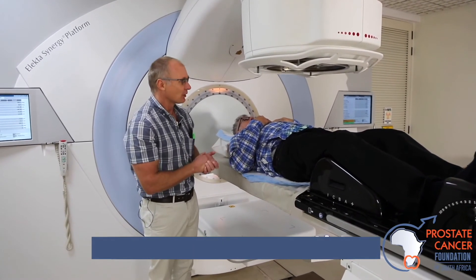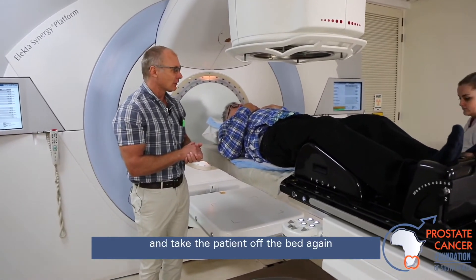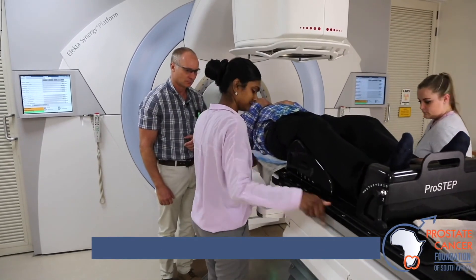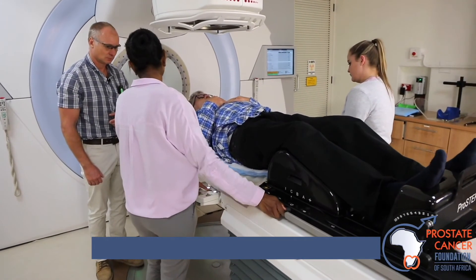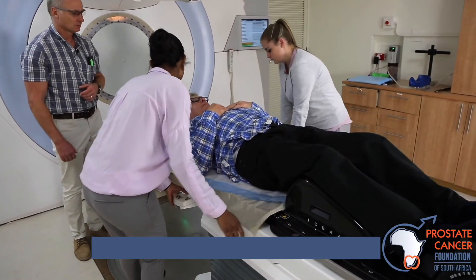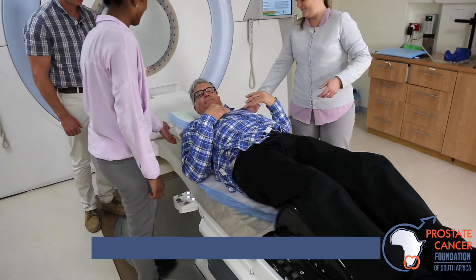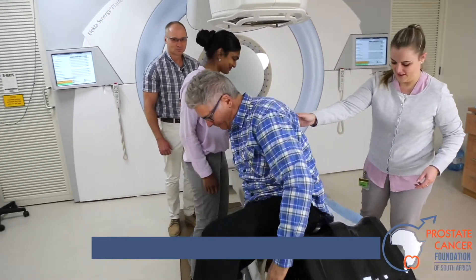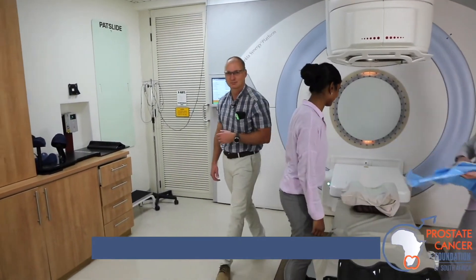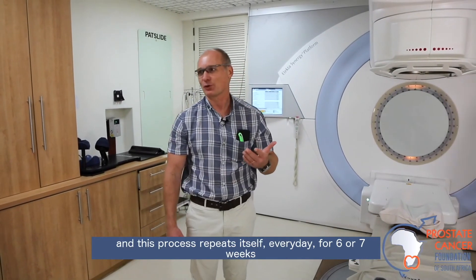Once that's done, the radiotherapist will come back into the room and take the patient off the bed again. This process repeats itself every day for 6 to 7 weeks.